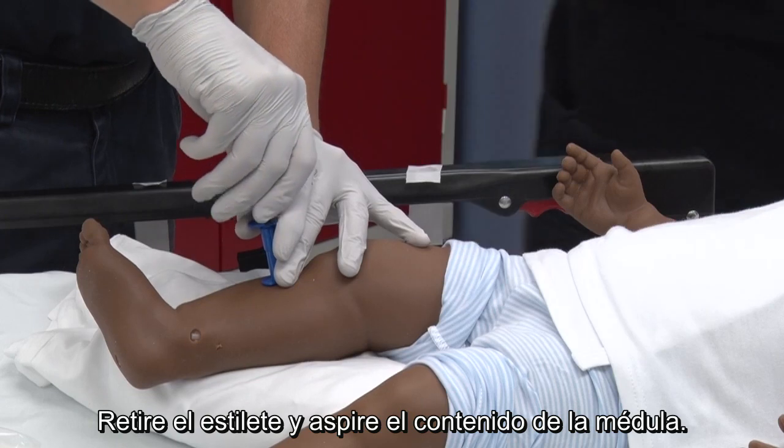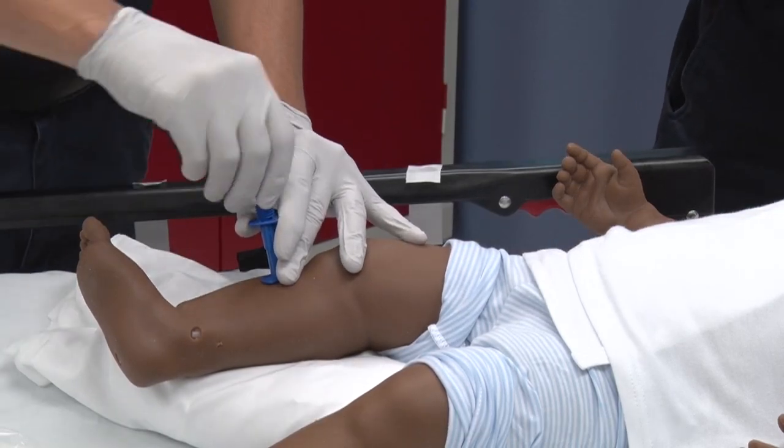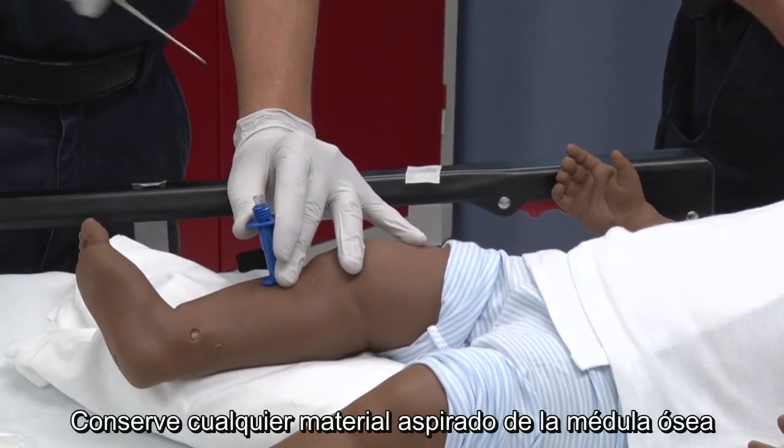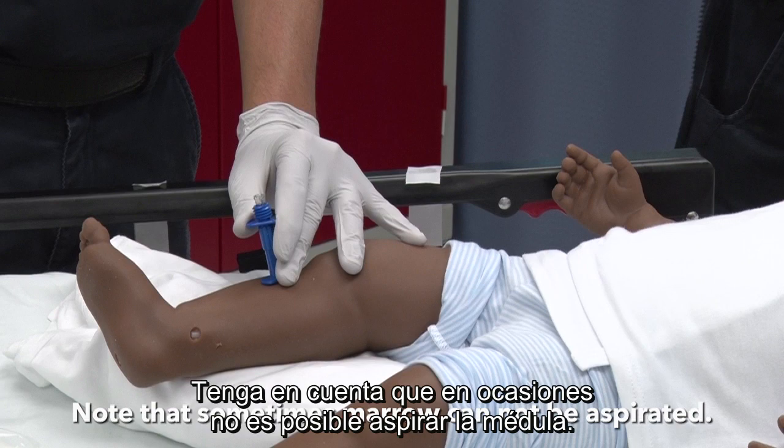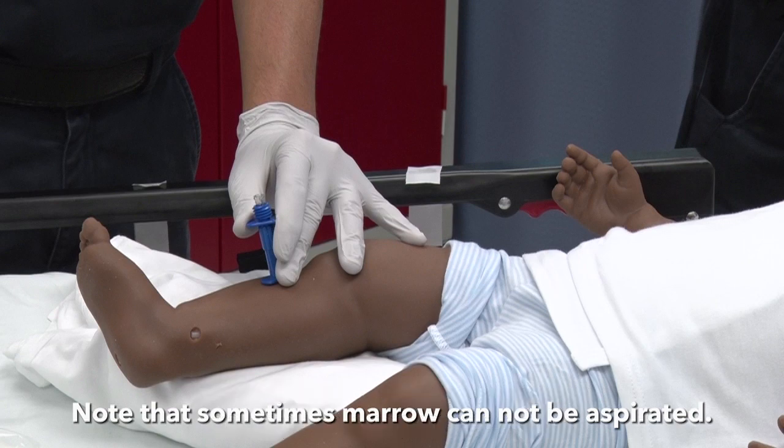Remove the stylet and aspirate marrow contents. Keep any bone marrow aspirate for glucose check or for other tests in the emergency department. Note that sometimes marrow cannot be aspirated.